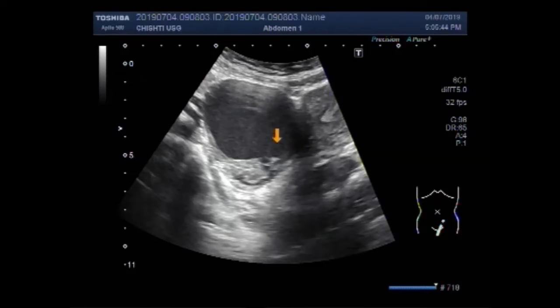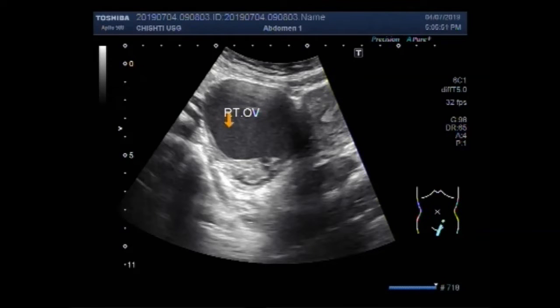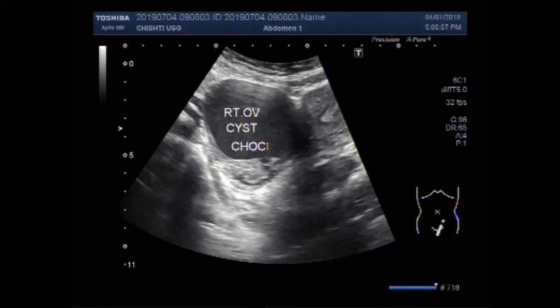The large right ovarian cyst has a lot of thick sludge in it. This is a right ovarian chocolate cyst — the sludge is homogeneous in consistency.